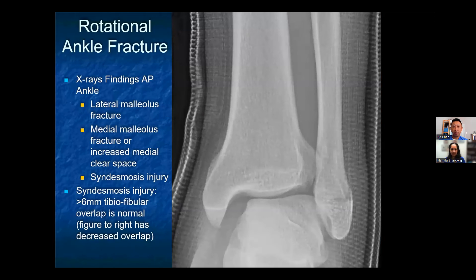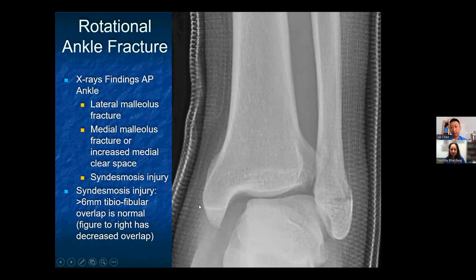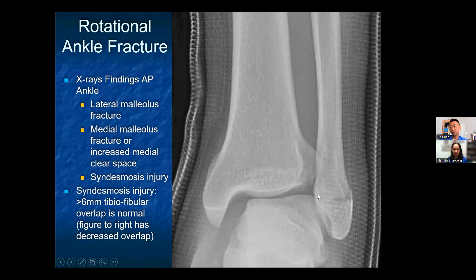On the AP view of a rotational ankle fracture, the lateral malleolus can be seen fractured. The medial malleolus is not always fractured — sometimes the energy tears the deltoid ligament, which connects the medial malleolus to the talus. On this x-ray, note the medial clear space — the space between the medial malleolus and the talus, also called the medial gutter. It should be about four millimeters or less. A wide medial clear space indicates an unstable ankle injury with a fibula fracture laterally and a torn deltoid ligament medially, and is usually a surgical indication.